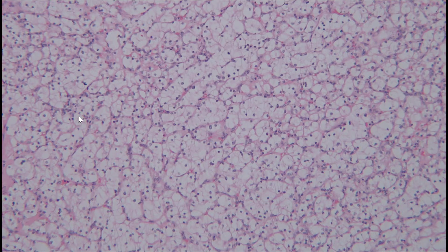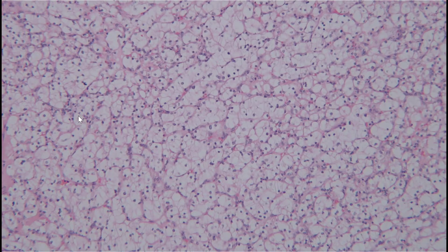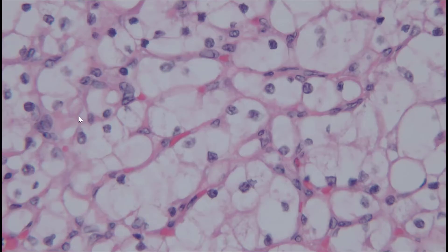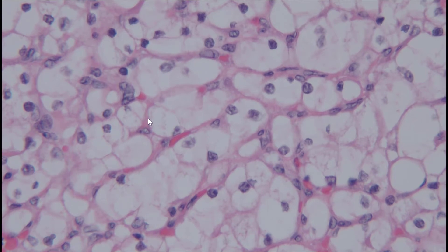At 10x, we're not really making out much in the way of nucleoli based on the camera's optics. On the 40x objective, we can begin to make out small nucleoli within some of the tumor cells. Overall there is some degree of pleomorphism — some cells are larger, some smaller — but it's not on the high end of pleomorphism.